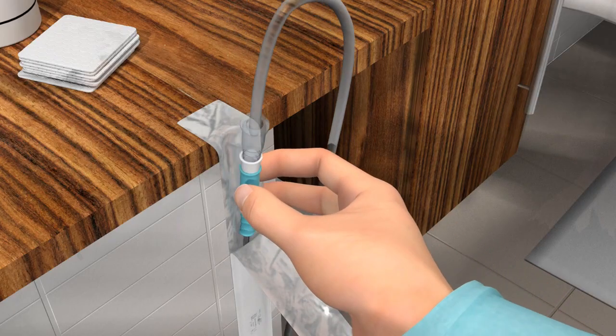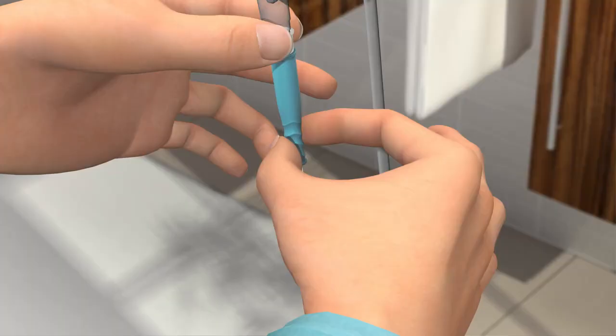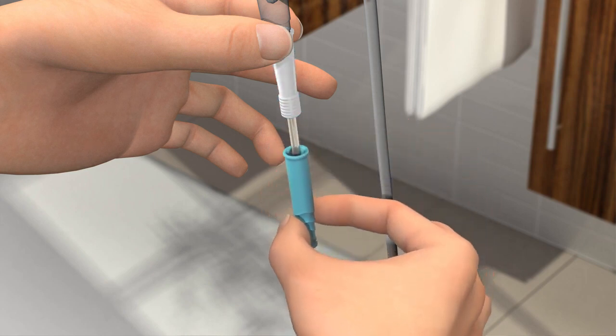Grab the turquoise insertion grip with your leading hand and lift the catheter out of the packaging. Loosen your grip of the insertion grip a bit and release it from the connector by pulling it downwards, then pinch the insertion grip again. For optimal grip, pinch on the wavy section of the insertion grip. Make sure that the catheter tip and surface does not touch anything before you enter it into the urethra — if it does, you must use a new catheter.